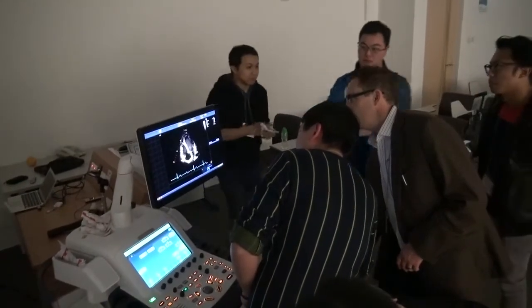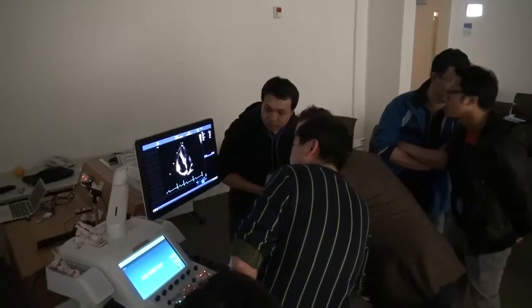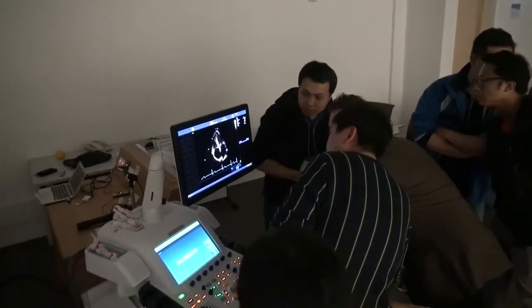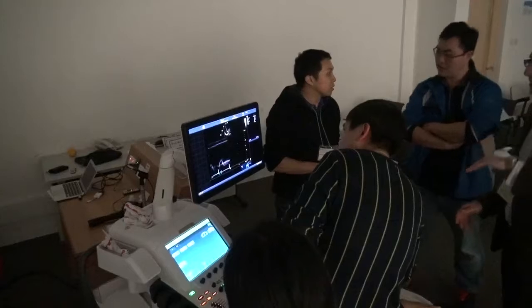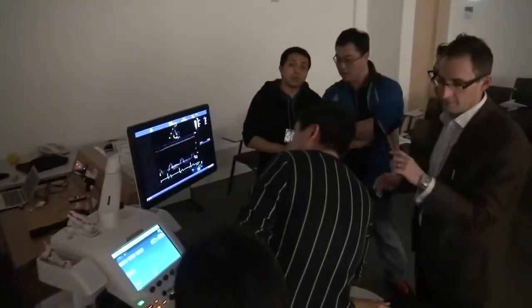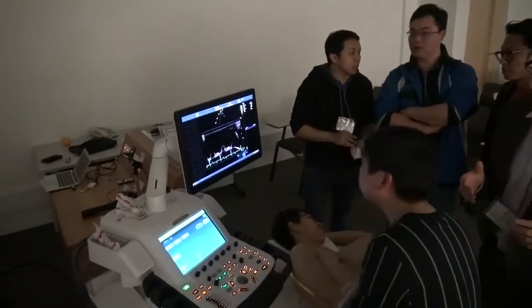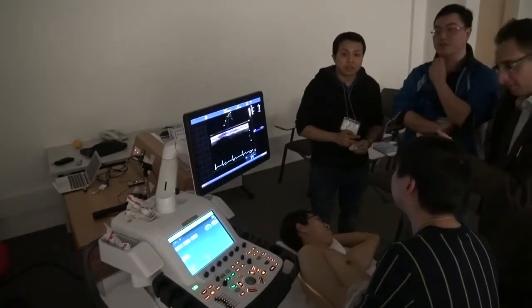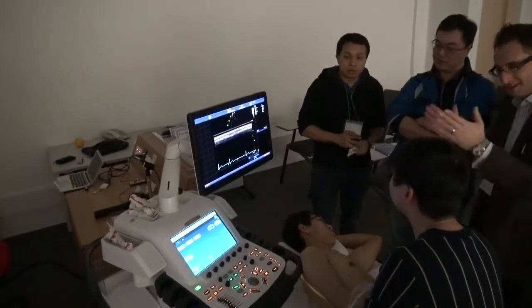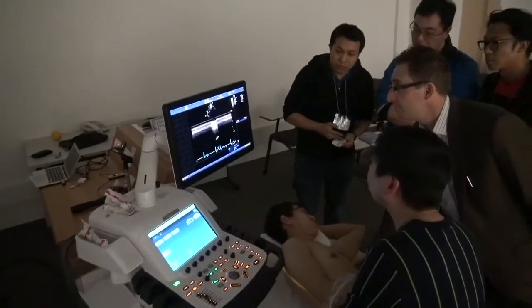And then what you're going to do, if you hold that there, you put a cursor through this area, and watch the movement of that. And this is longitudinal movement of the ventricle. Now the longitudinal movement of that ventricle relates to its overall function. And if you think about the right ventricle, it predominantly shortens in that longitudinal aspect, so it goes down like that, with less squeezing and more longitudinal movement. So TAPSE is really easy.